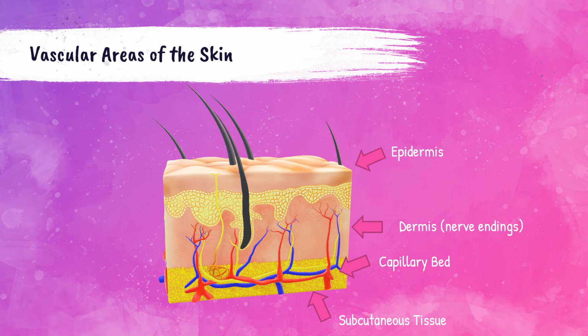To produce adequate blood flow for a dermal puncture procedure, the depth of the puncture is much less important than the width of the incision. This is because the major vascular area of the skin is located at the dermal subcutaneous junction. This junction is located under 1.6 millimeters below the skin in a newborn patient and under 3 millimeters below the skin in an adult patient. Dermal puncture devices can reach this area pretty easily.